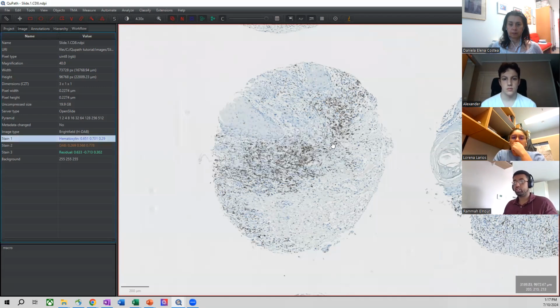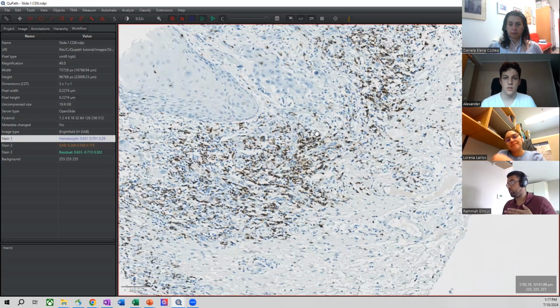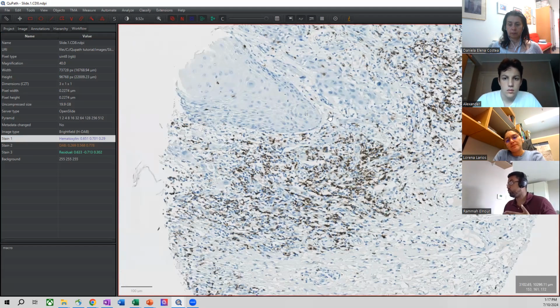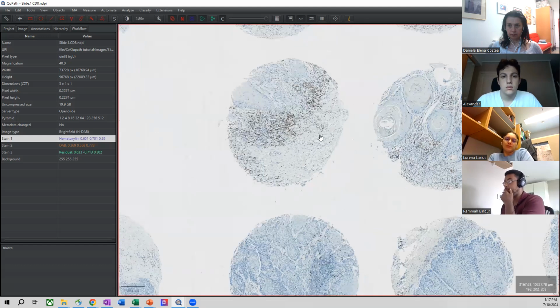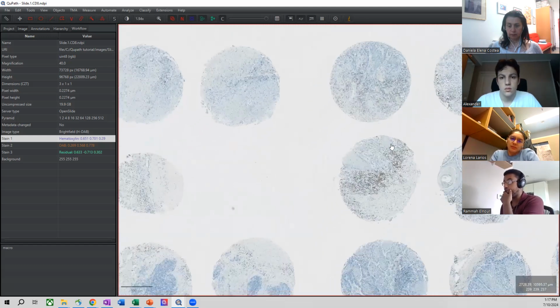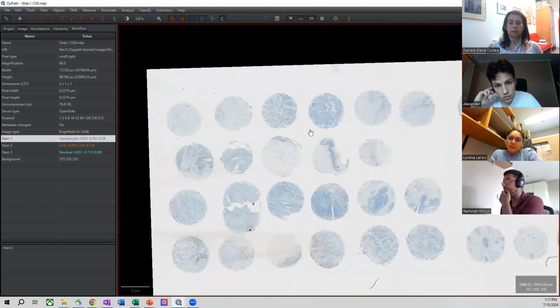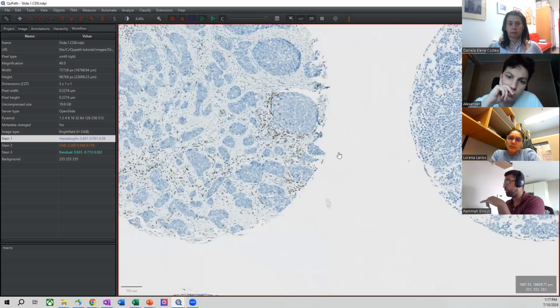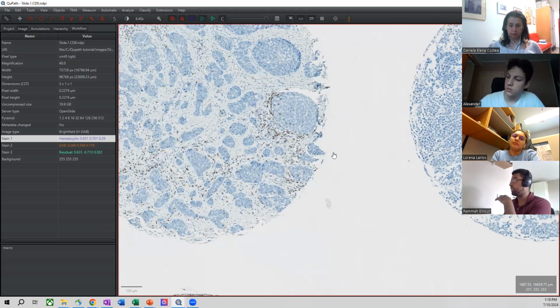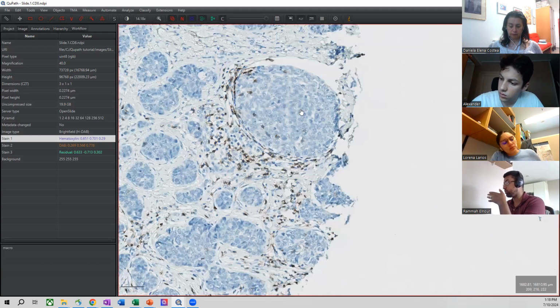But as mentioned, me personally, I'm not very familiar with the color deconvolution. So what I like to do is I like to use QuPath to help me estimate the staining vectors. There's a function for this. And basically, what Peter Bankhead recommended is you try to find a region that has a good representation of all of the different properties that you're looking at. So you want to have an image that has a significant amount of background, a significant amount of your tumor cells, but also your stromal cells, and also cells that are unstained, so only stained for hematoxylin and blue, and cells that are stained in brown for the cytotoxic T cells you need.